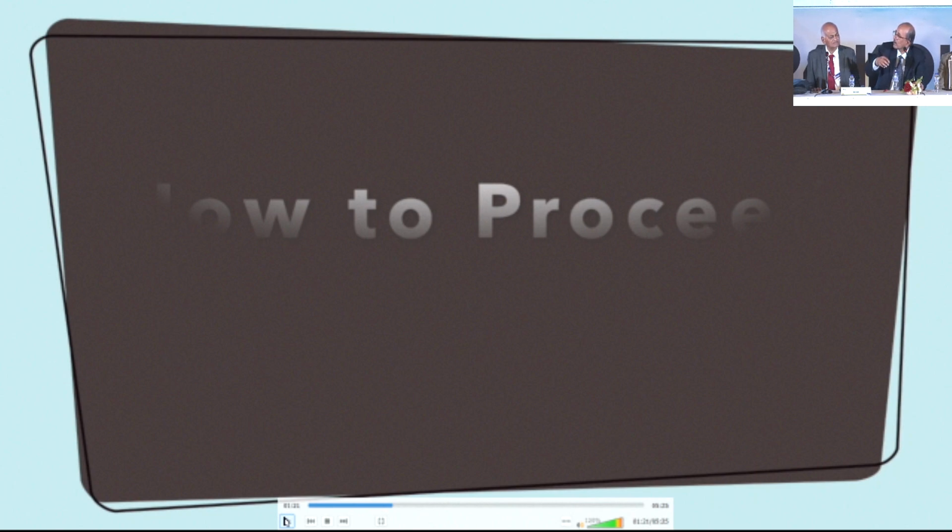You removed the cortex also very well. Yes, sir. So now we have to see whether there is a PCR, what is the extent of the PCR, and what should be done, whether we can implant the IOL into the capsular bag, or whether a 3-piece IOL or single-piece IOL is required. That we have to decide.